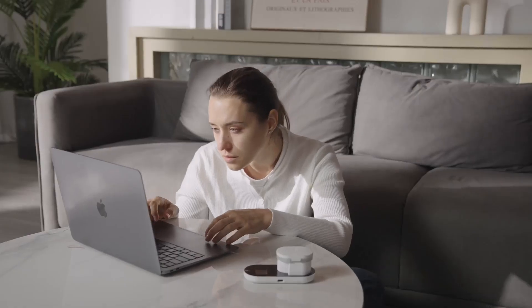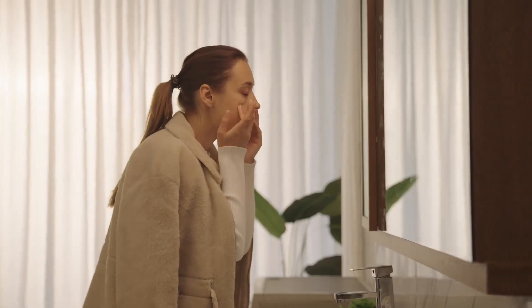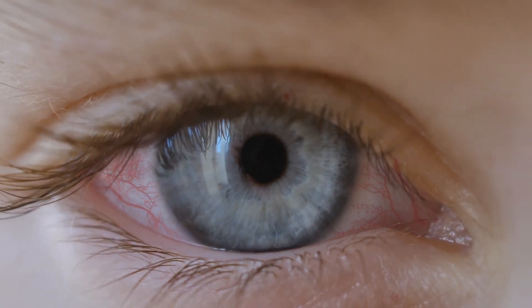Did you know that your contact lenses might not be getting cleaned thoroughly enough? Regular contact lens solution can't remove the tear proteins that get absorbed into your lenses over time.